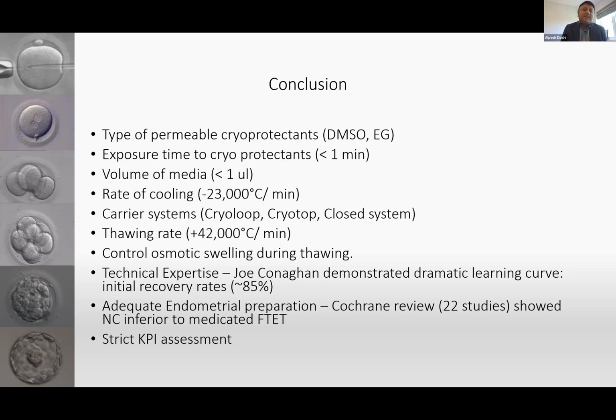In my experience, I can tell you that when I've been troubleshooting in a laboratory between practitioners, it's always been the warming that has been the culprit. And this is where we need to train our embryologists very intensively on the warming. And of course, as I said, the learning curve is quite important. We want to make sure that every embryologist or practitioner has had adequate practice, exposure, training before they're performing anything clinical.